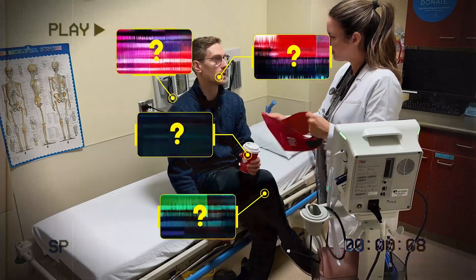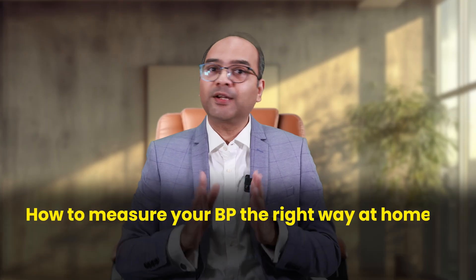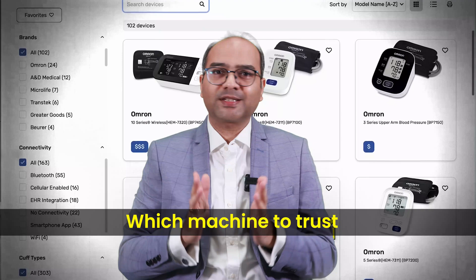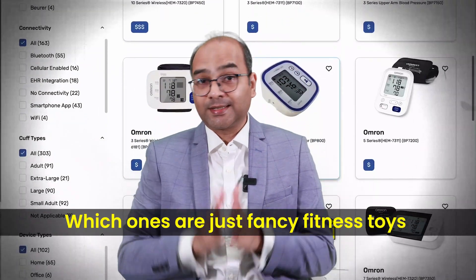So today we are doing what most people skip: how to measure your BP the right way at home. And yes, which machines to trust and which are just fancy fitness toys. This episode could save you from a lifetime of wrong diagnosis, unnecessary medications, or worse, missed warning signs. So let's dive in.